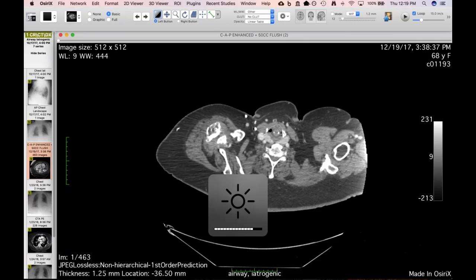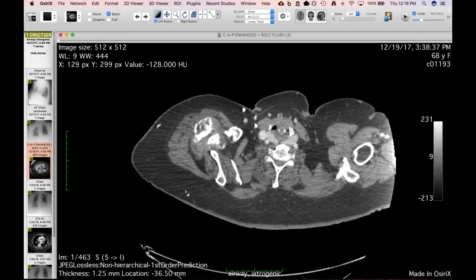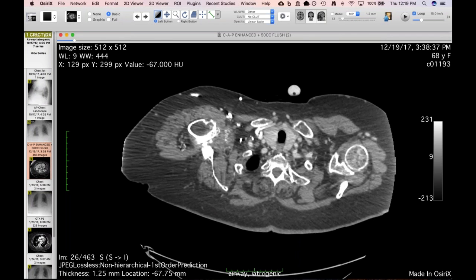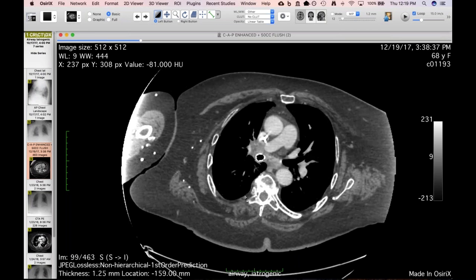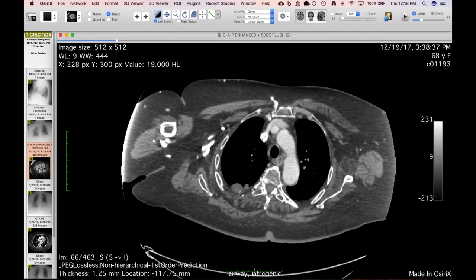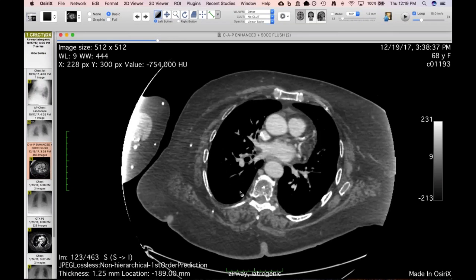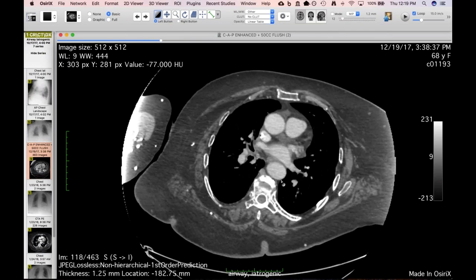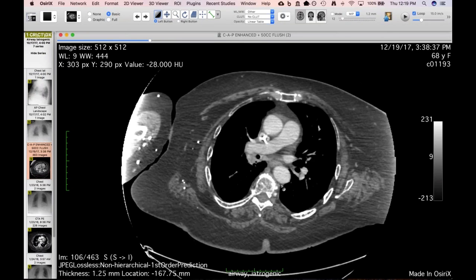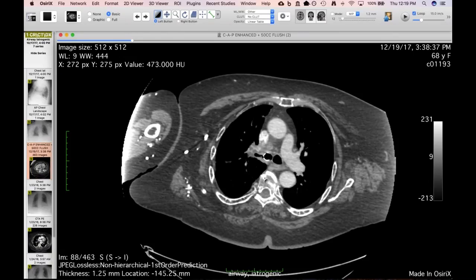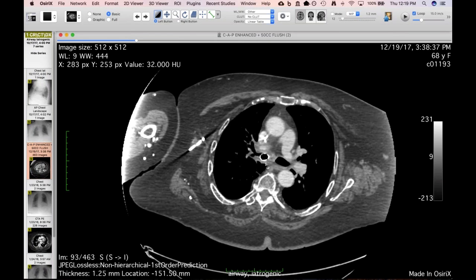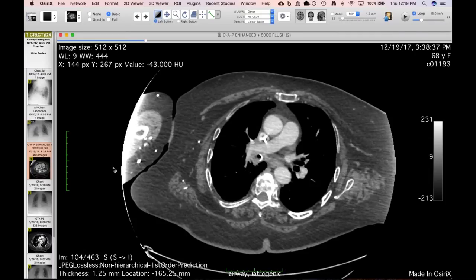My fellow brought this one to my attention. This is a lady with metastatic small cell lung cancer with some pleural and internal mammary disease. When she originally presented, she had obstruction of her right-sided airways, so they placed an endobronchial stent in the right main stem bronchus, just distal to the carina.